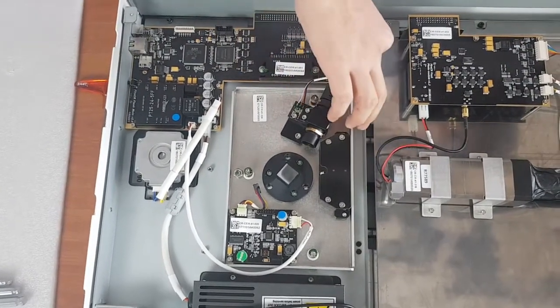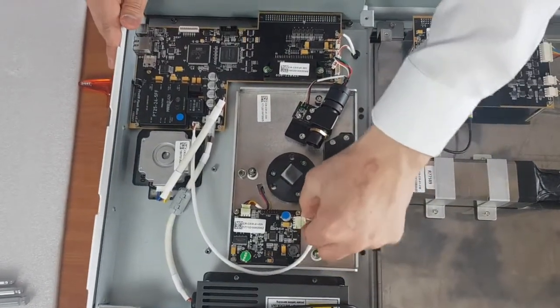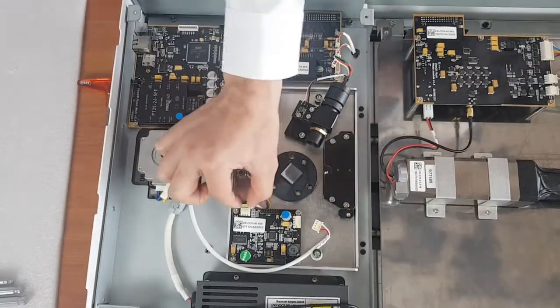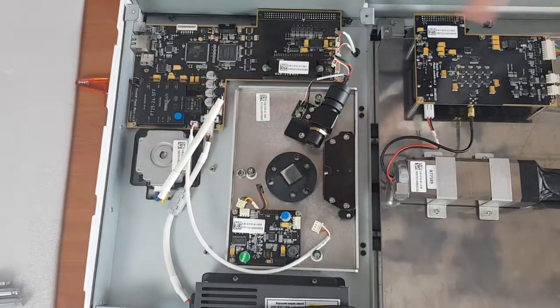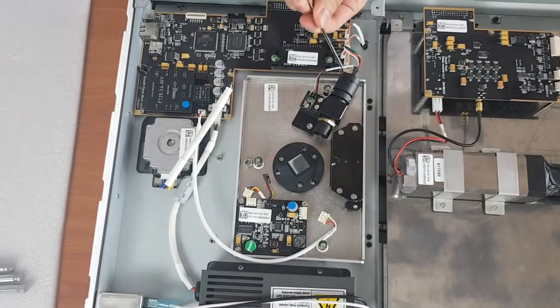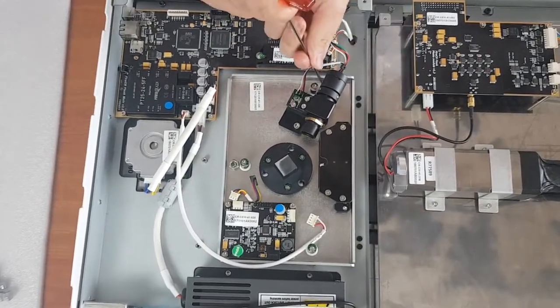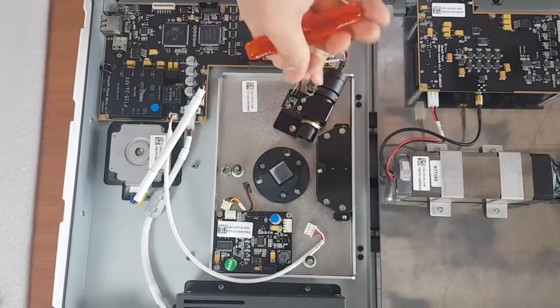I'll remove the cables first. Then remove the screws. Be careful because there's a washer underneath — try not to lose them.